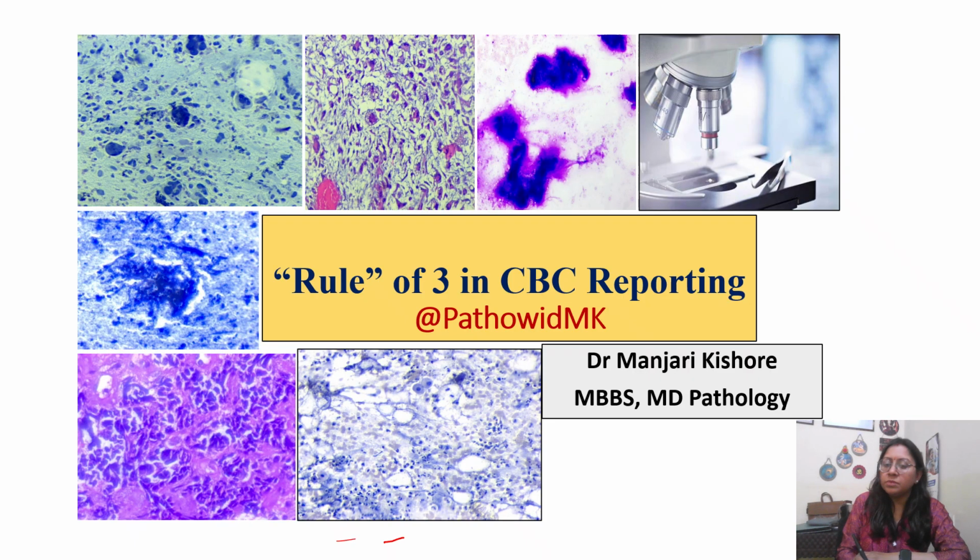So, in short, today we'll be discussing the rule of three, and this rule of three is important in our complete blood count reporting, commonly known as your CBC. तो जब भी हम CBC टेस्ट के लिए जाते हैं, it's a blood test और CBC के सैंपल हम लेते हैं EDTA vial, okay, the lavender top colored vial. So in that you have EDTA as your anticoagulant. So in that you take sample for your CBC, complete blood count.